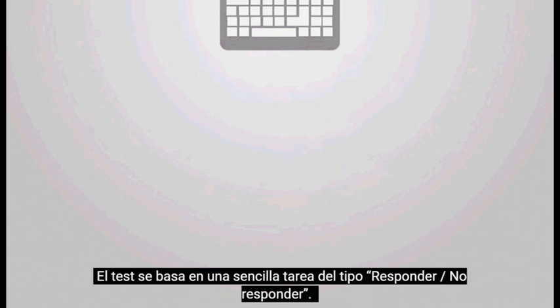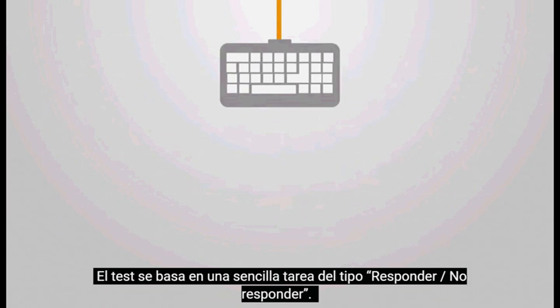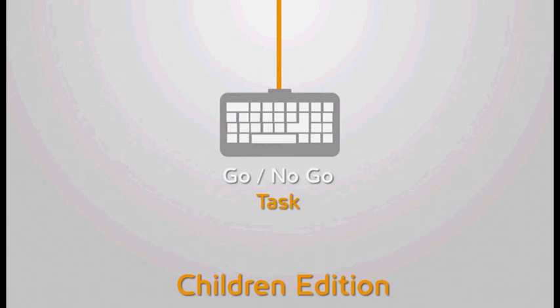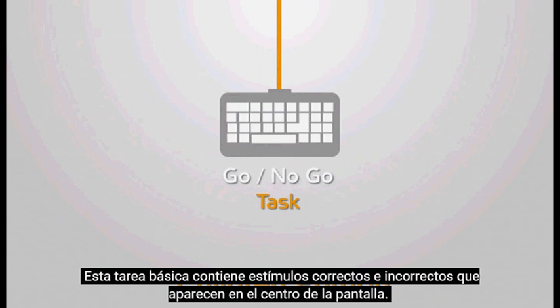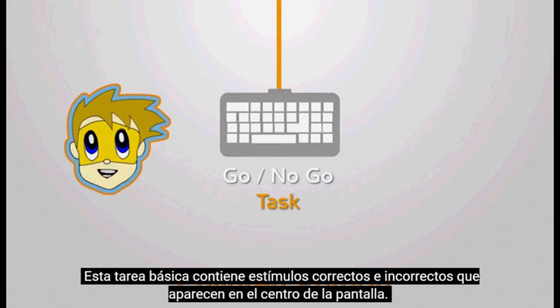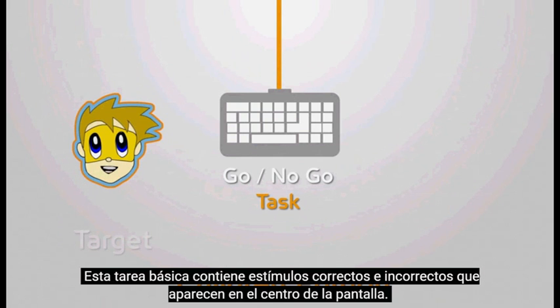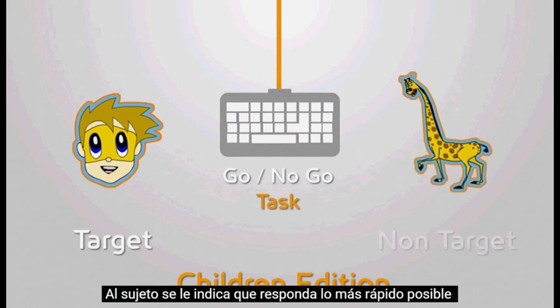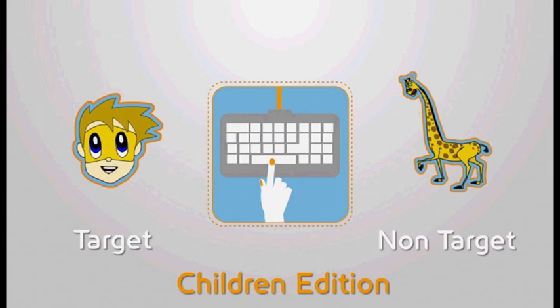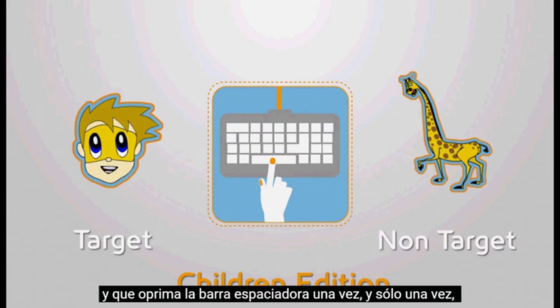The test is based on a simple go-no-go task. This basic task contains target and non-target elements appearing at the center of the screen. The patient is instructed to respond as fast as possible and to press the spacebar once and only once each time the target element appears.